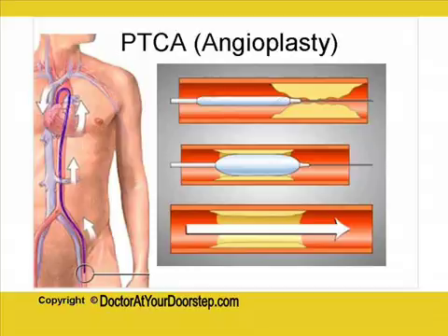Once it reaches the area, as you can see in the right sided diagram, where there is a blockage, the deflated balloon reaches inside that place, and it is then inflated. When it inflates, it traumatically breaks down that blockage and opens up the artery for the free flow of the blood. Angioplasty has the inherent disadvantage that after some time the chances of re-stenosis, or the blockage occurring once again, are rather high. Therefore it's not a permanent kind of treatment.